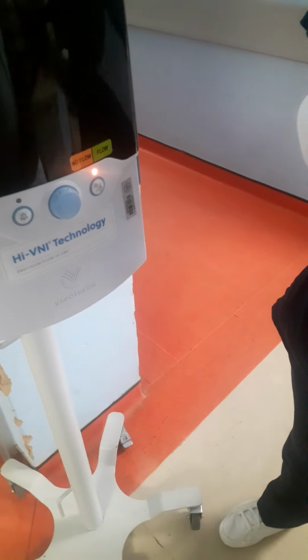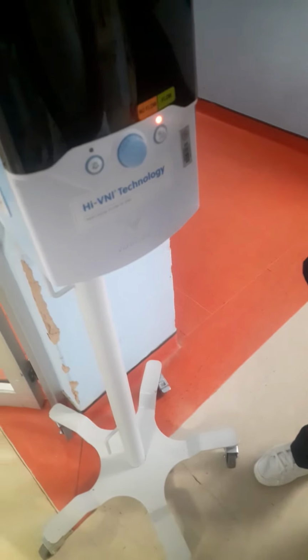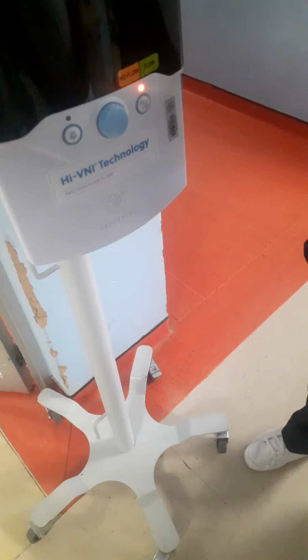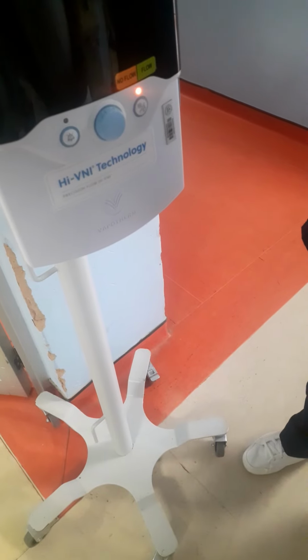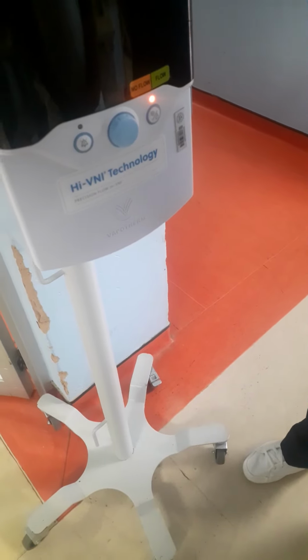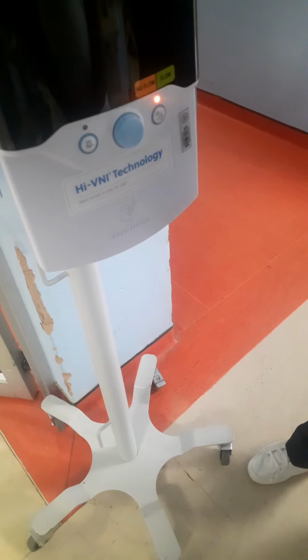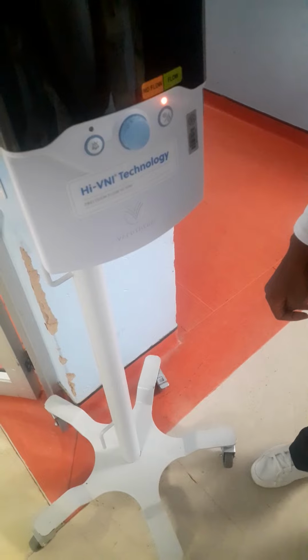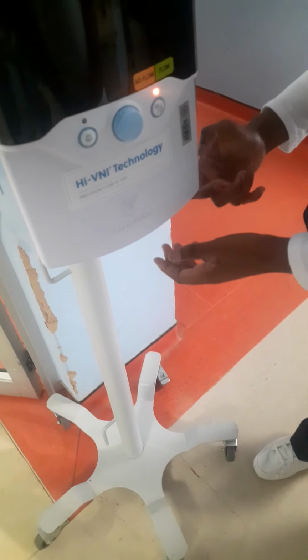When we had the COVID patients and when we had the cascades installed, the thing that you hook the cascade on, the brackets. We didn't have brackets before, so the brackets were supposed to be mounted on the vent.